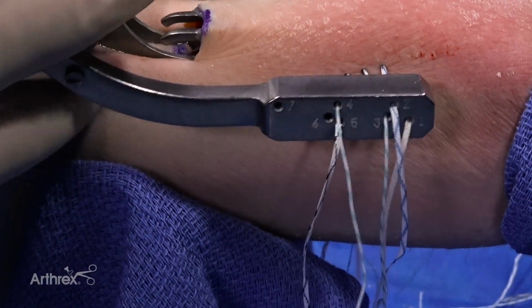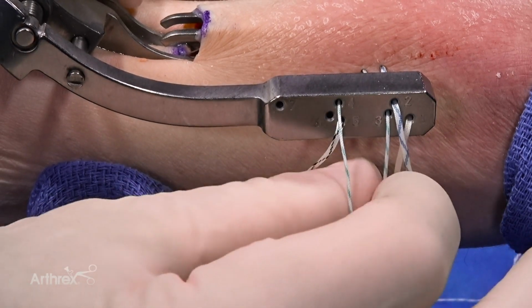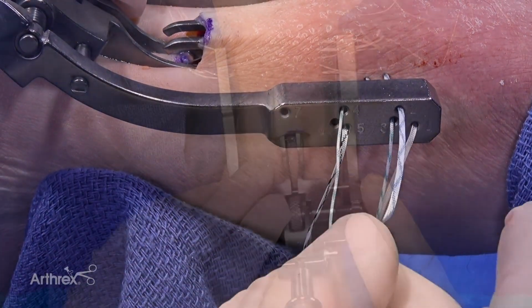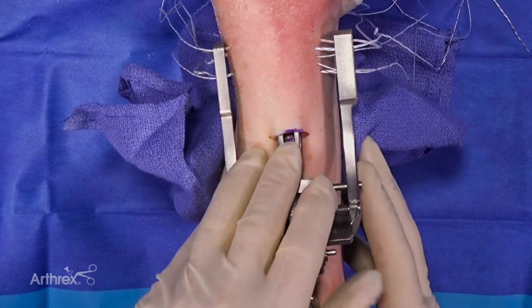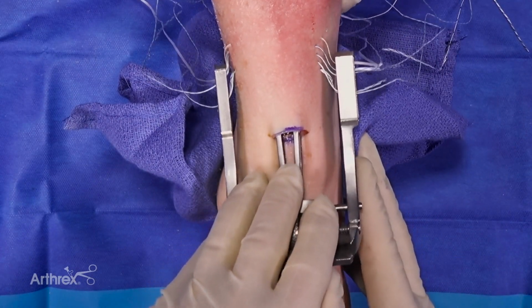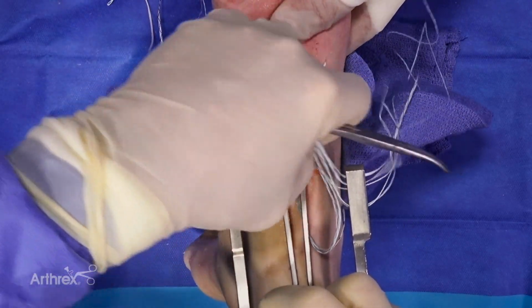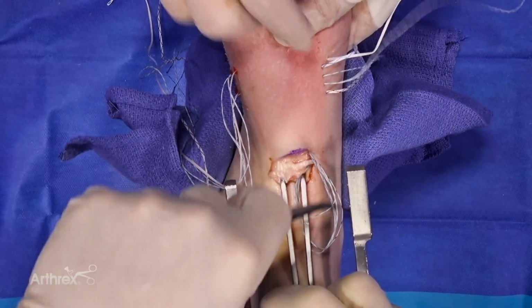As demonstrated here, by just having 1 lock suture, we're actually going to have our blue stripe suture become our lock suture. So at this point in time, now with all our suture tape and our loop suture in proper position, I'm going to draw this out. And you'll see that I can then go ahead and take these out. I know where I am. Take this. It's all about suture management.